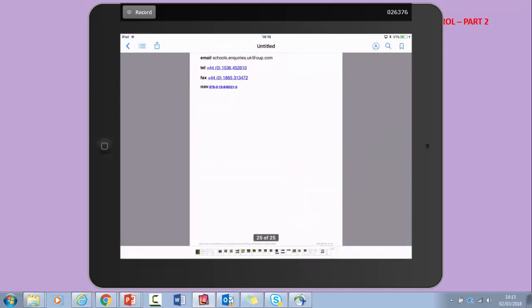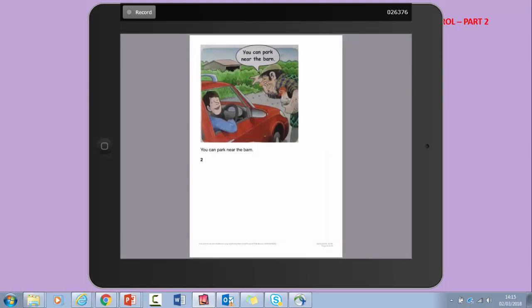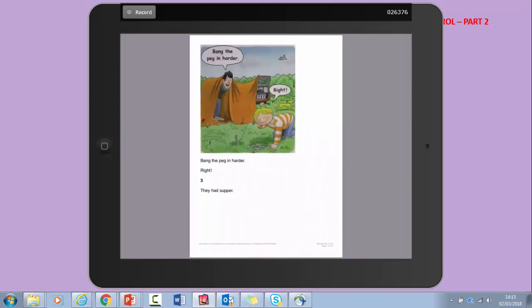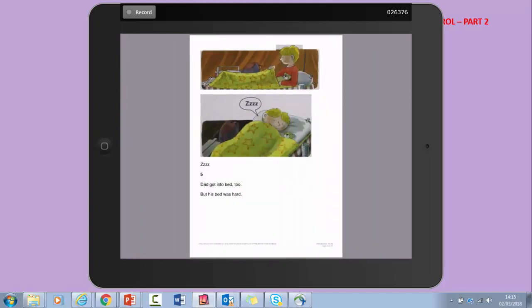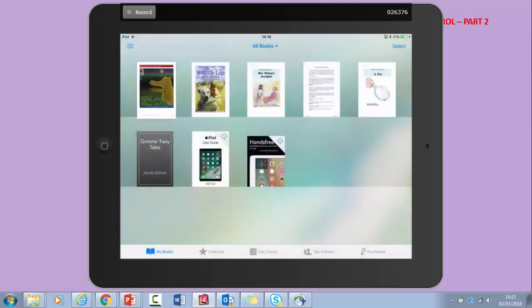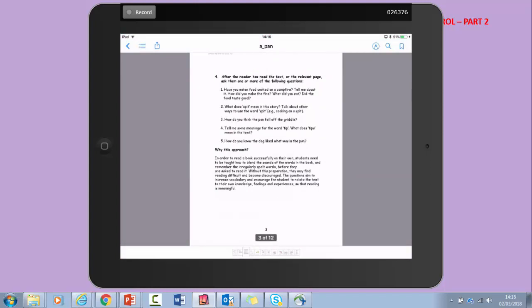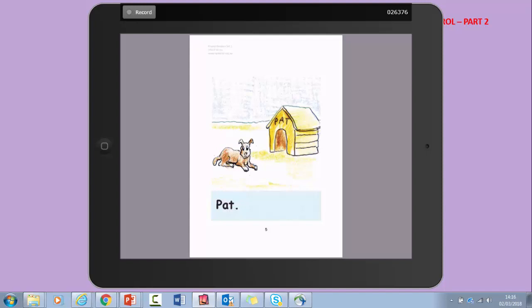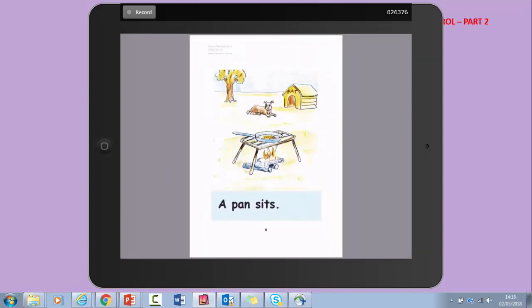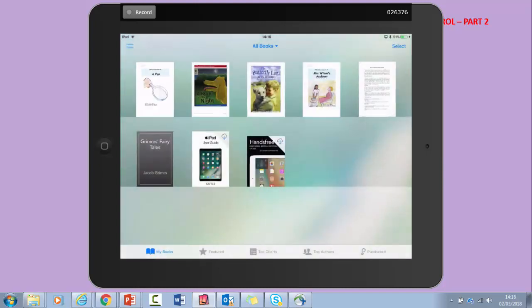Another example of a book. This one was from Seeing Ear, I think. Now, this one has got quite a few pictures in it. Obviously some text not being read, but the switch is moving those pictures forward. And again, one from SPELD, again predominantly a pictorial book. And the pupil is able to control those pages by pressing the switch. So that's all done within iBooks.